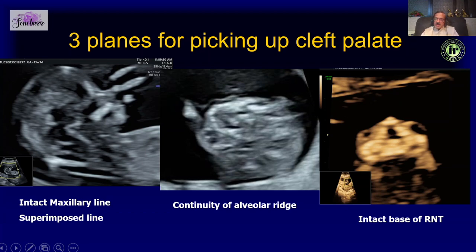In the axial plane we can also look at the continuity of the alveolar ridge — the same plane used in the second trimester, though of course you don't see the uvula at this stage. We should also make sure that the retronasal triangle is intact. These three planes help us in picking up cleft palate.